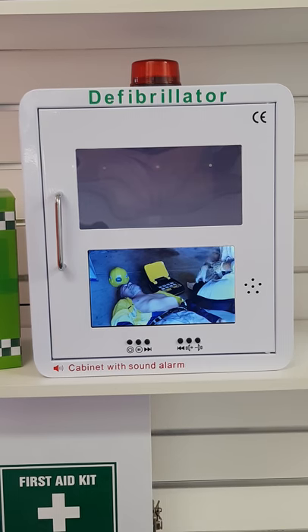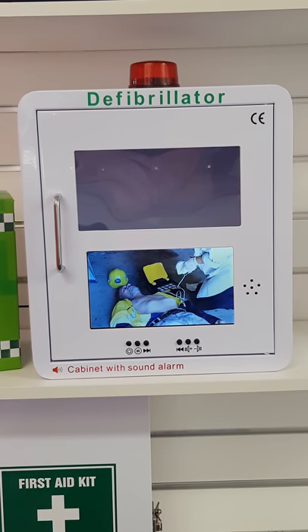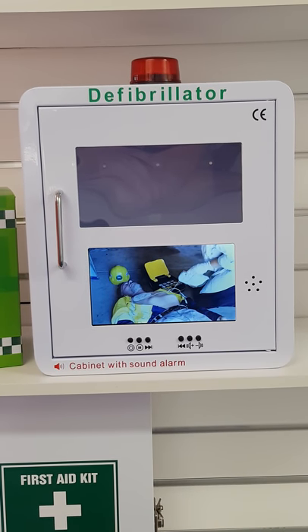Unit OK. Plug in pads. Insert connector firmly. Remove clothes from the patient's chest. Place pad exactly as shown in the picture. Press pads firmly to patient's bare chest.